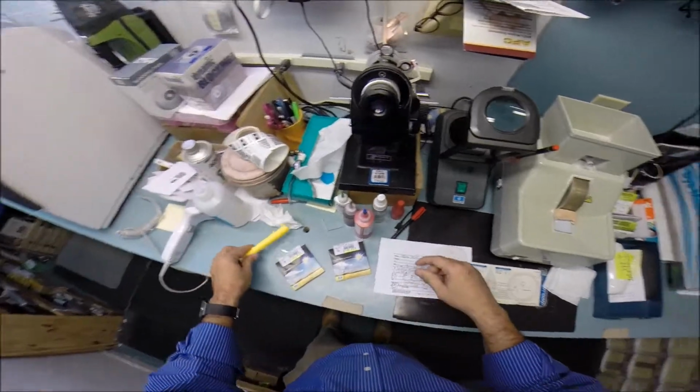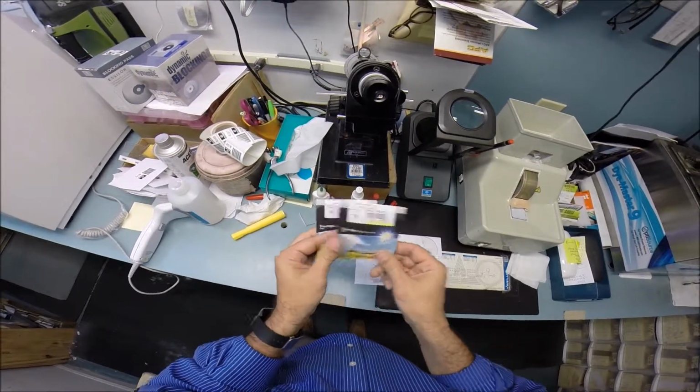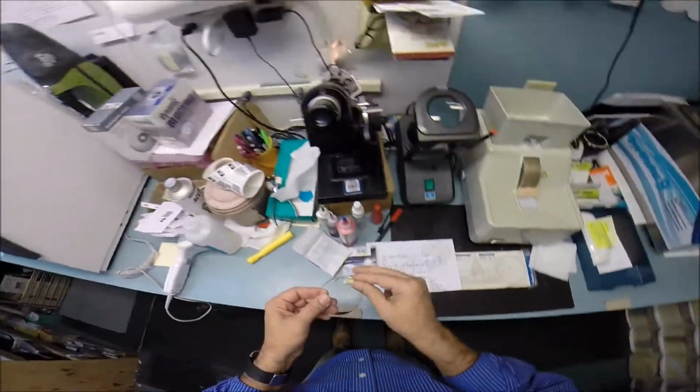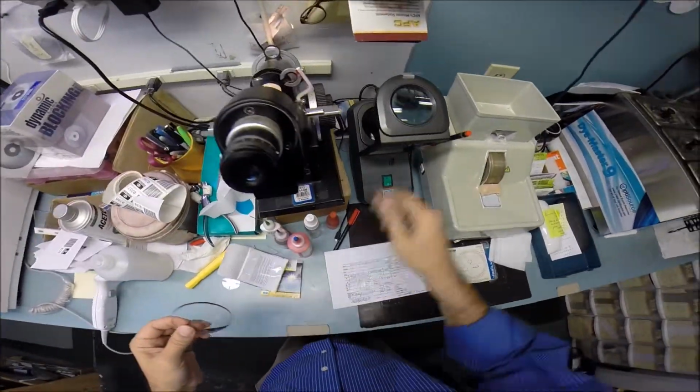And just for fun, I would write right and left, but you're the same in both eyes. That's why I was switching. It really didn't matter which was right or left. I can't get that wrong until after I put these dots on there. Once these lenses are oriented, they have to go into the frame just that way.